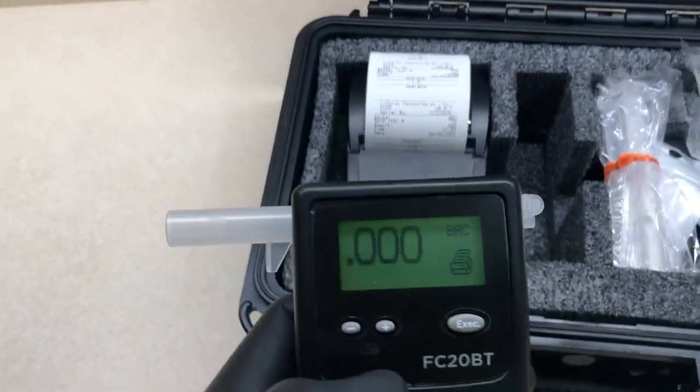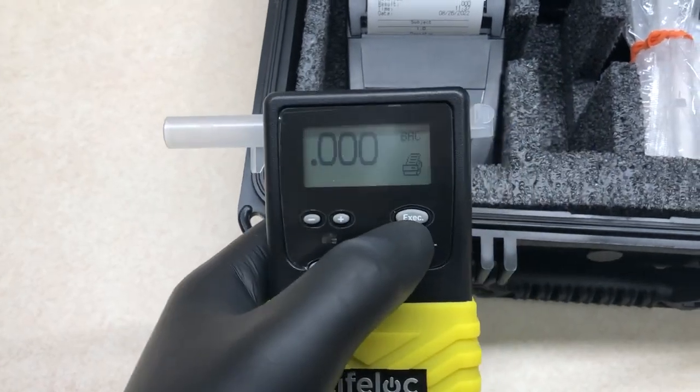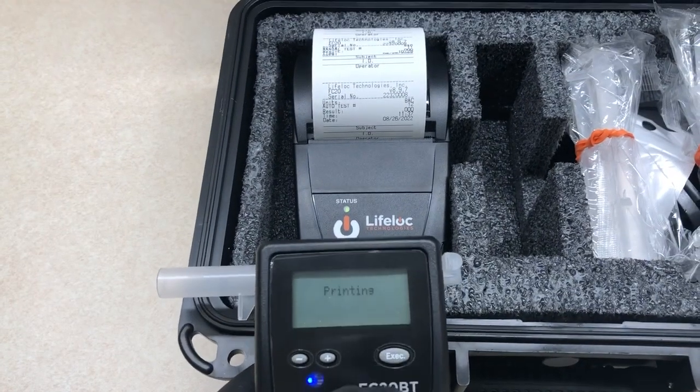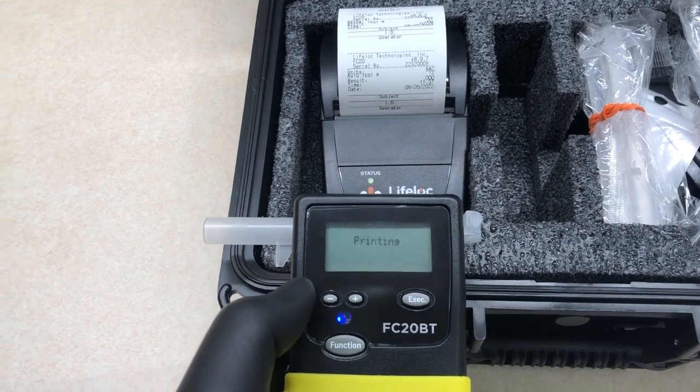0.000. And then to print, all you're going to be doing is make sure you have your printer on. This button that says execute, it has a printer sign right above it. So all you're going to be doing is hitting that printing sign. You don't have to be near it, at least I don't think so.